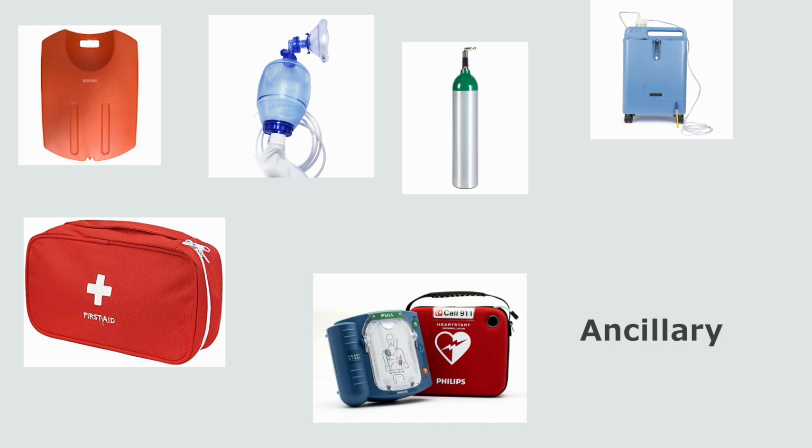I believe the AASM recommends a log to make sure these things are always in working condition, because the last thing you want during a heart attack is an AED with bad batteries. A standard first aid kit should also be available. Oxygen concentrators or cylinders may be used if it's not a hospital that has oxygen piped into the rooms from the walls. Also, you'll need printers, scanners, copiers, telephones, and office computers to do all the tedious and menial stuff.